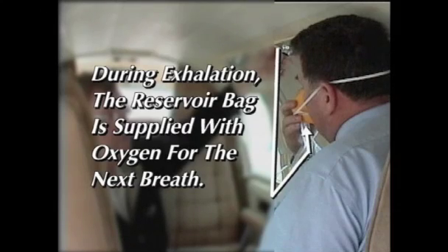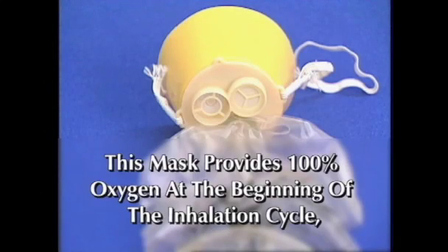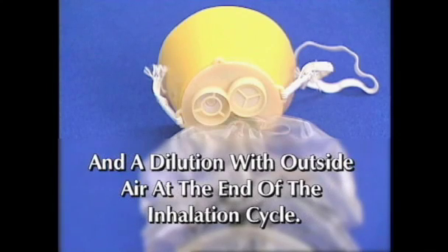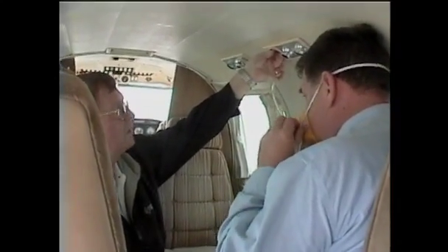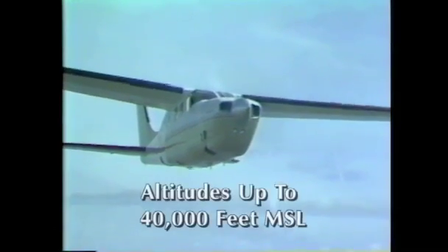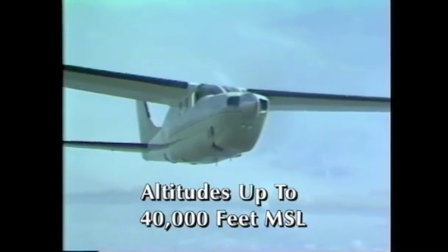During exhalation, the reservoir bag is supplied with oxygen from the regulator in preparation for the next breath. This mask provides 100% oxygen at the beginning of the inhalation cycle and a dilution with outside air at the end of the inhalation cycle. The user does not rebreathe any exhaled air. With the proper flow rate, the phase sequential mask will supply adequate oxygen for a short duration emergency at altitudes up to 40,000 feet mean sea level.